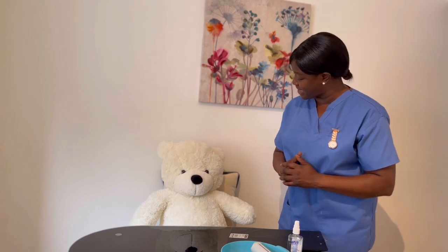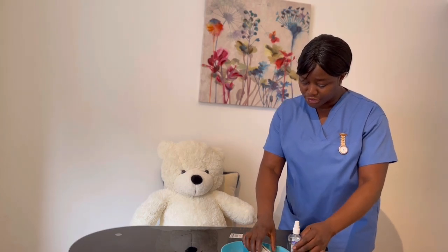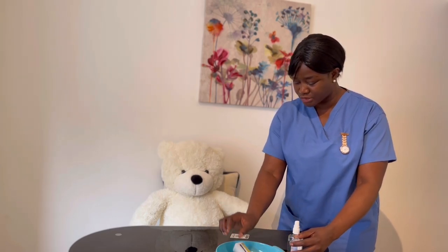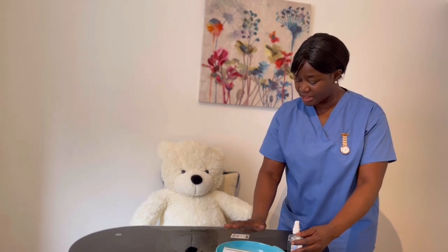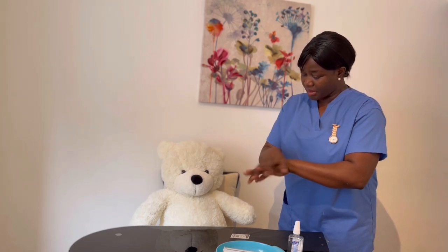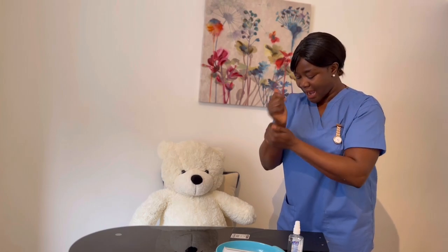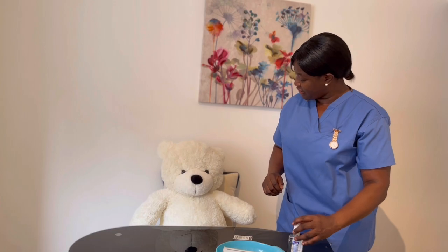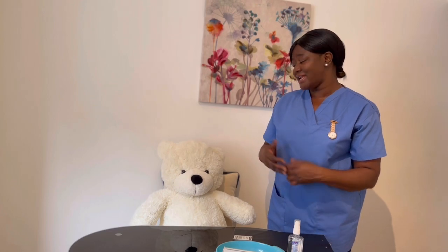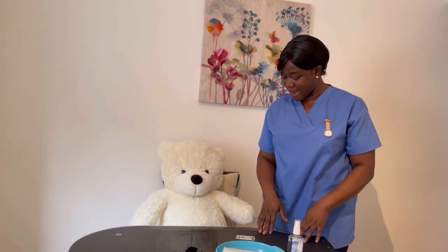Harry, do you have any concerns or questions for me? No, I'm all right, nurse. I'm going to make sure the apparatus is clean and kept with you since it's a single individual use device and belongs to you. We're going to clean the tray and make it ready for next use. I will do my final hand hygiene according to WHO standard. I'll be leaving you for now — if you have any concerns, you can always ring your GP. Do you have your GP's number? Yes, I do. And in case of any emergency, you can dial 999.